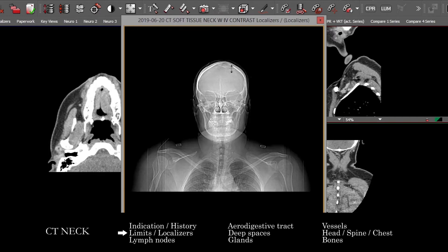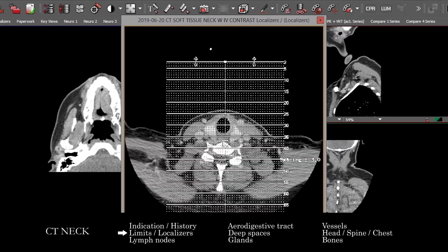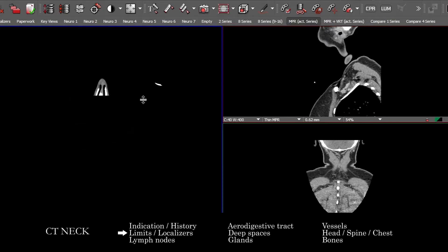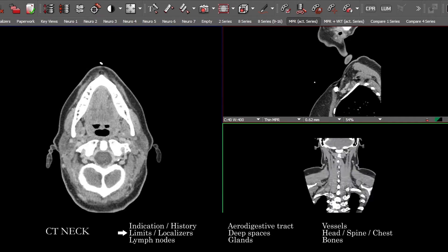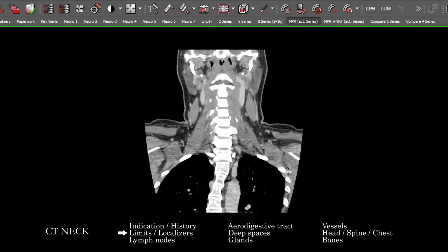So here is our approach to the CT soft tissue neck. Once I've gotten a sense of what's going on with the patient, I take a quick look at the localizer images, particularly the lower and upper aspects where we may not see the same anatomy on the cross-sectional images. Once I've done that, I bring up the study in an MPR viewer with planes corrected for the patient's anatomy.